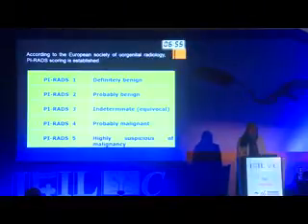The PIRADS scoring is established to provide common communication between the radiologist and the clinicians. The European Society of Urogenital Radiology established this scoring, where PIRADS 1 and 2 are more likely to be benign lesions, while PIRADS 4 or 5 are more likely to be malignant lesions.